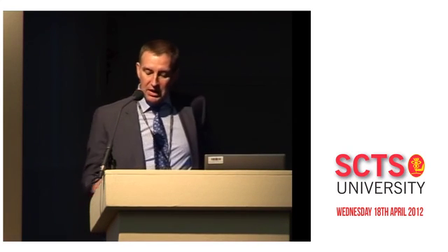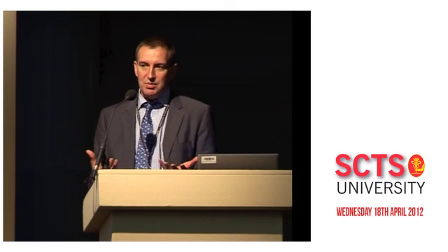My point really is, if you put the probe down, should you do a full interrogation? No, I take exactly what you're saying, because we're encouraged never to do a limited study or a focused study, we're encouraged to do a full study. I think the answer probably is to do a full study in 5 minutes. You're not looking for any other specific pathology. You look at the right ventricle, the left ventricle, the valves, you exclude any major pathology without doing all 20 multiplane views. For a reasonably experienced operator, and if the cardiologist can't do it, then you push them out of the way and do it yourself, it should take 5 minutes, really.